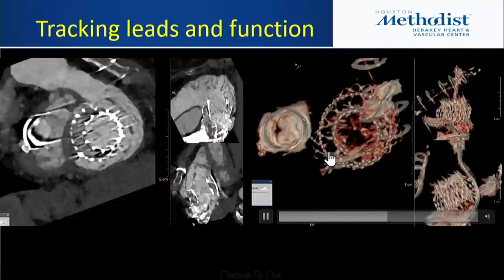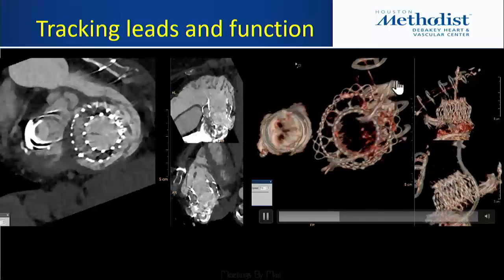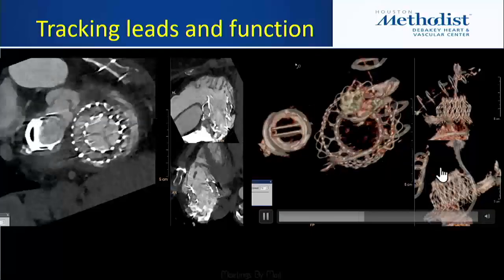It's actually impacted and flexed up the flange of the TTVR device. But then they had the new lead go through the valve. And you can track all of this very easily. You can see the device-device interaction beautifully on CT.